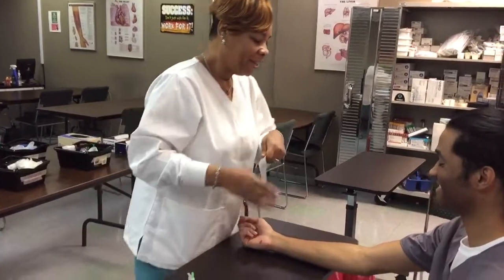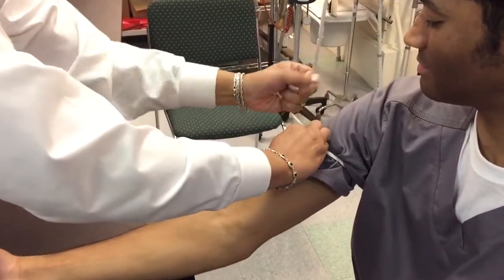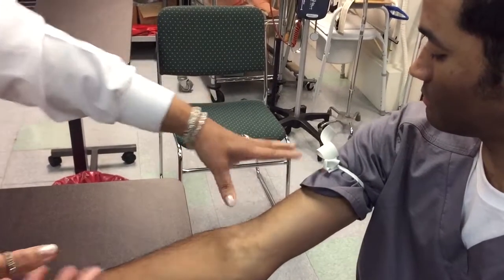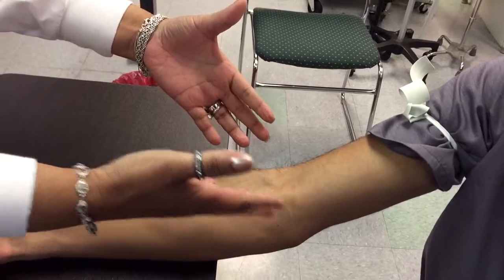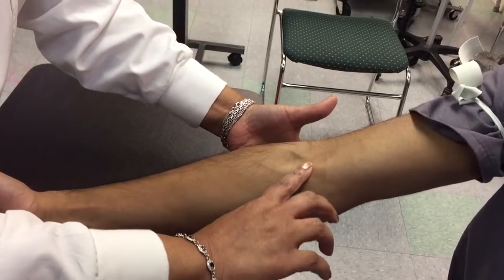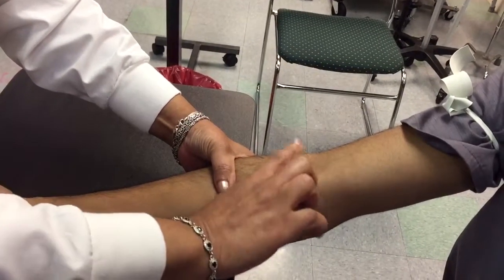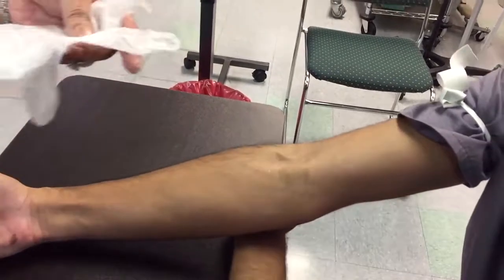Now we are going to tie the tourniquet on. I like my tourniquet tight, but be careful — if it's too tight, it can hemolyze your specimen and interfere with the values of the test. Feel around to find out which vein you're going to use. That medial vein right there — that's the go-to for phlebotomists, and I like that one today.